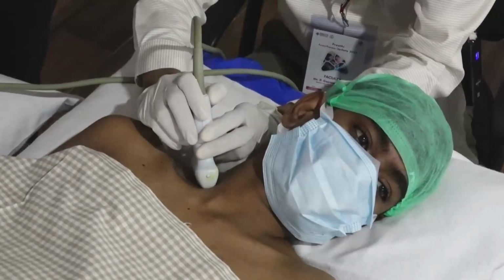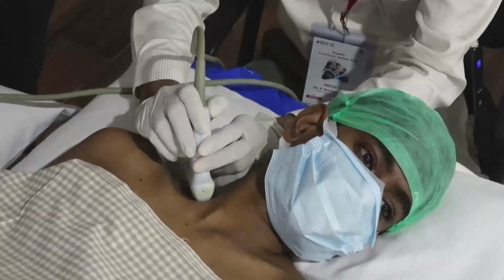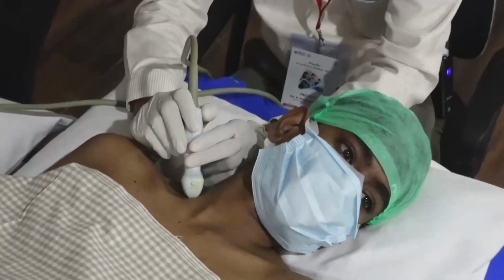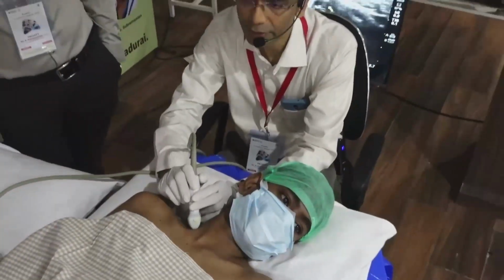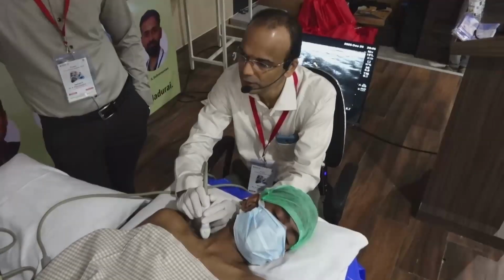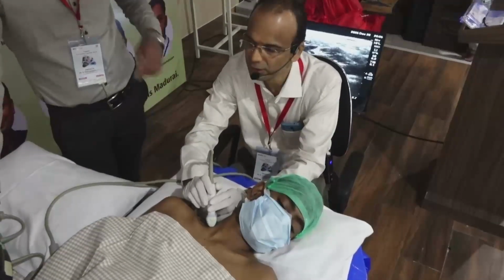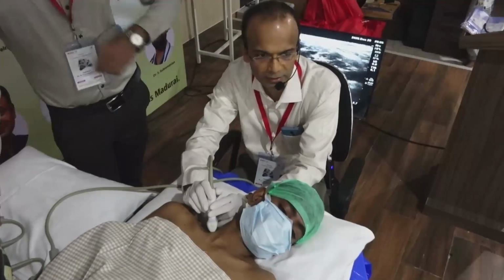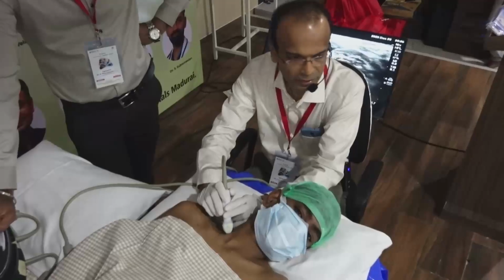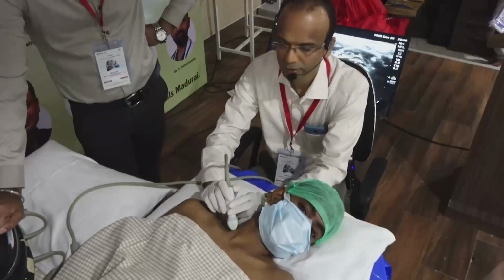Then the other muscle we see is the middle scalene. We all know the brachial plexus is formed from C5 ventral rami to T1. But sometimes, as the book says, prefixed and postfixed plexus can be there, but those things are very difficult to differentiate. Otherwise, if you scan up to C4, you might be able to trace.